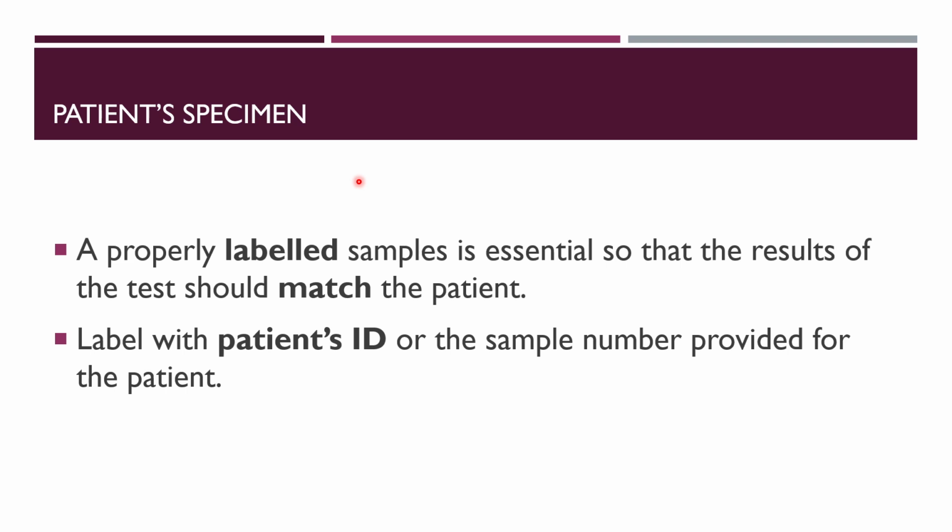So there is very low chance of mismanaged labels, and some laboratories also use registers nowadays in order to reduce the risk of mismatching the labels, or we can say samples.